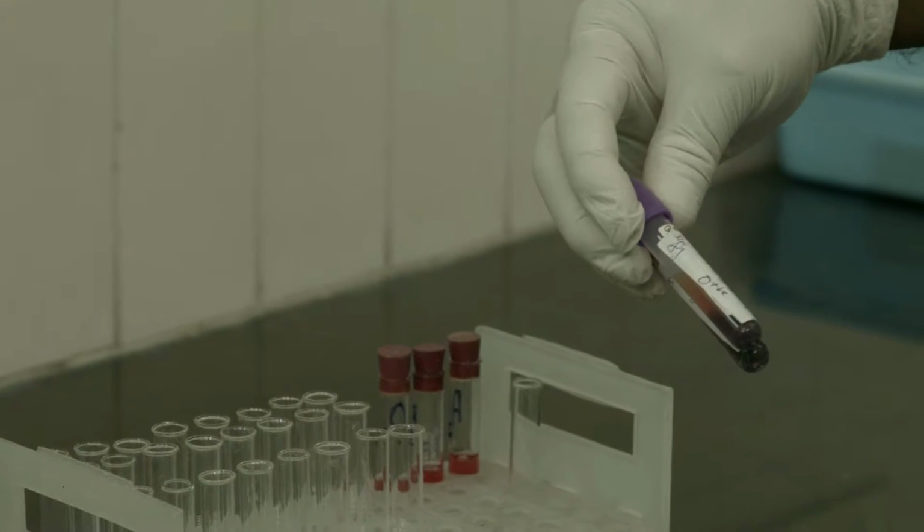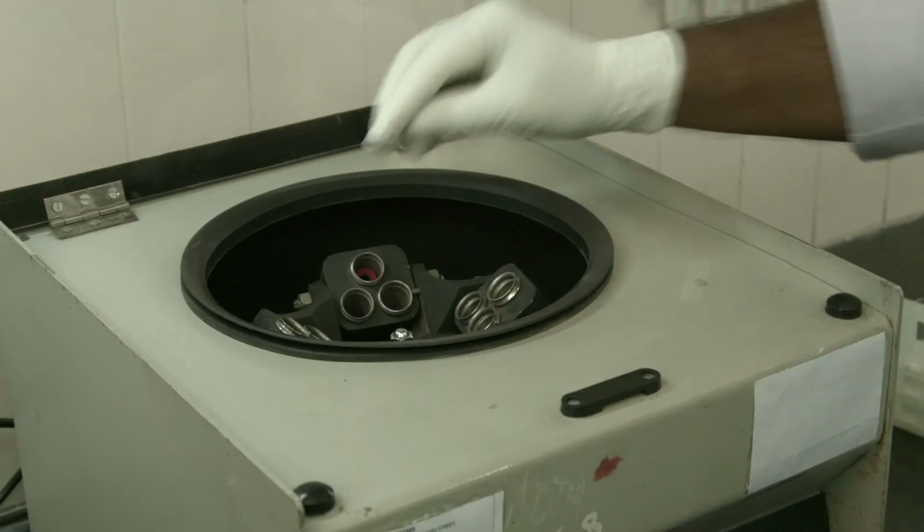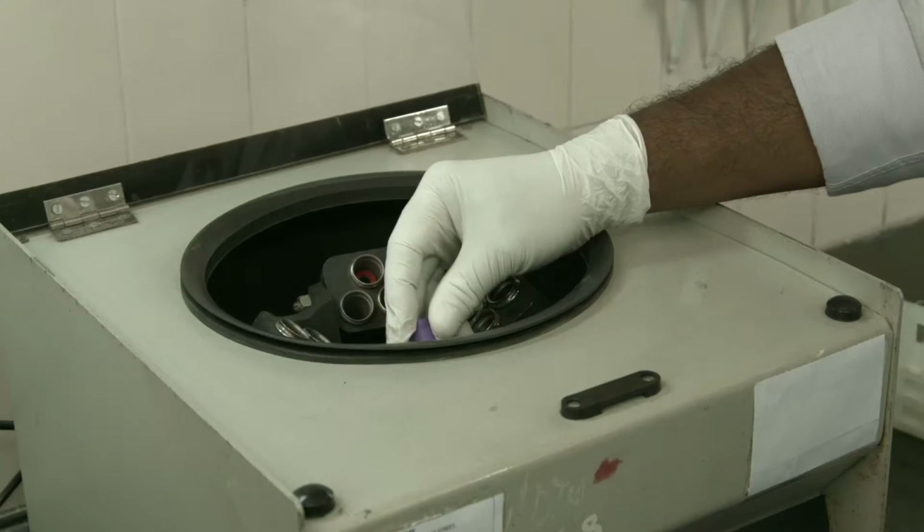Now moving over to the procedure, let's see step 1. Centrifuge the blood sample at the rate of 3000 rpm for 3 minutes to separate serum and cells. Make sure that the balance is maintained.